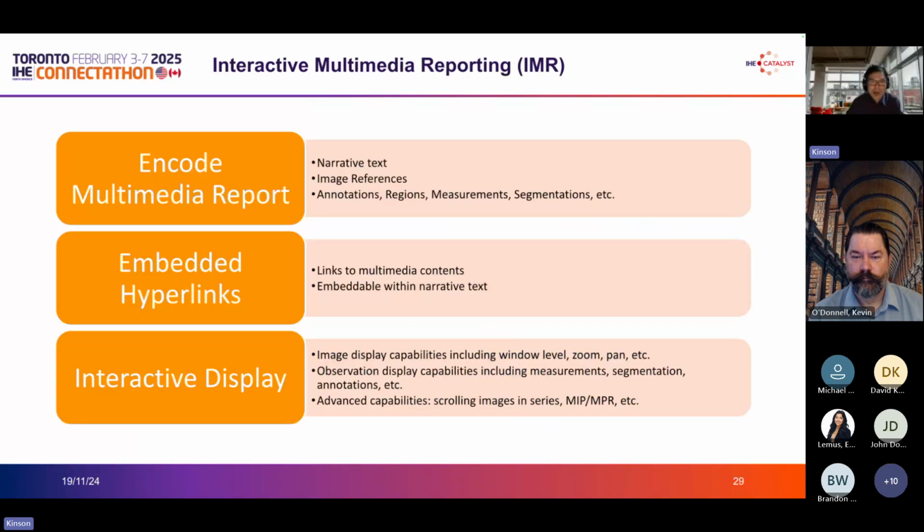The second profile I mentioned earlier is the IMR. It mainly focuses on 3 different parts. The first part is how to encode the multimedia contents. So there's the narrative text that's similar to the reporting text in a radiology report today.